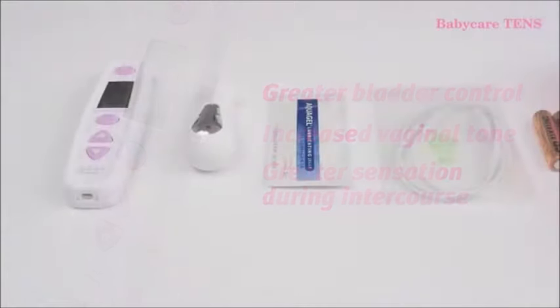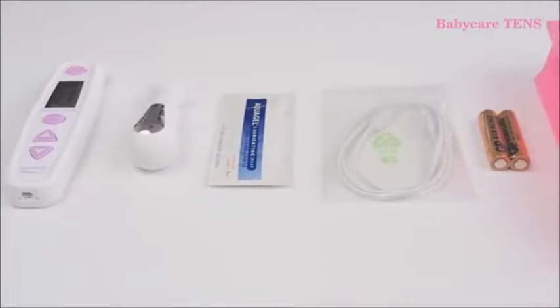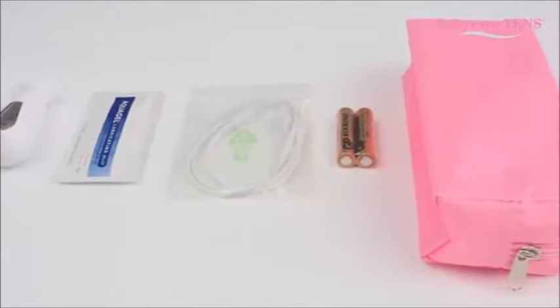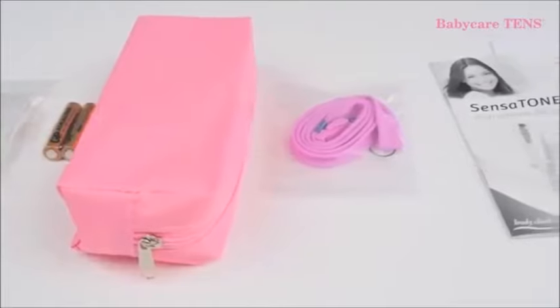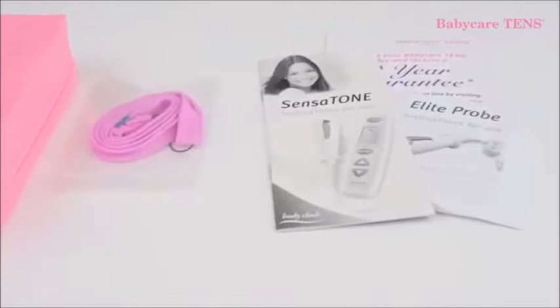Okay, so let's have a look and see what's supplied inside the box. Firstly, the Sensitone itself, a vaginal probe and a sachet of lubricant gel, one lead wire, two batteries, one simple smart carrying case and an easy release neck cord. Finally, an in-depth instruction manual.